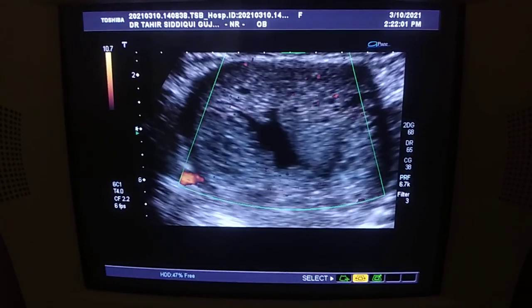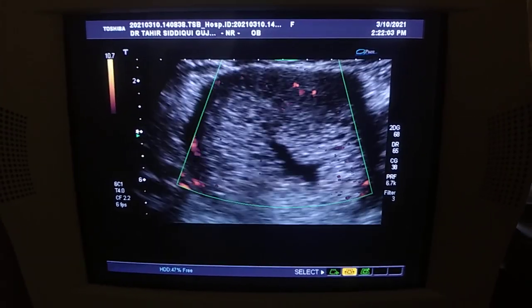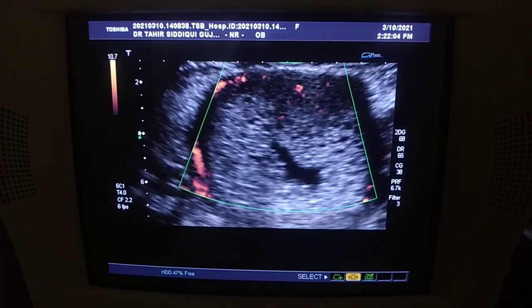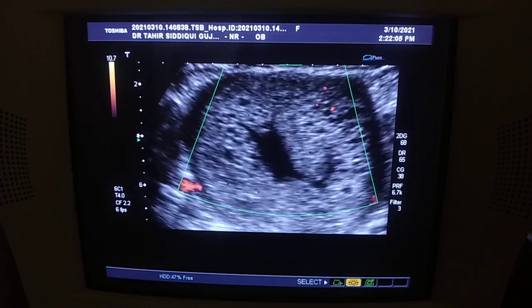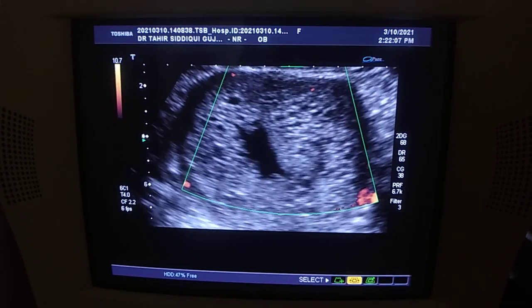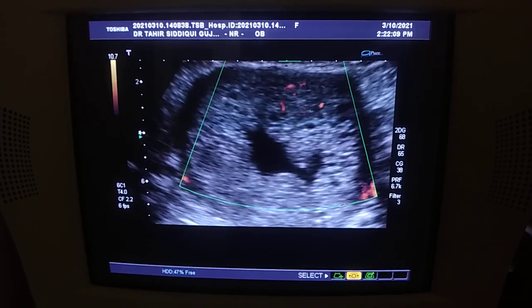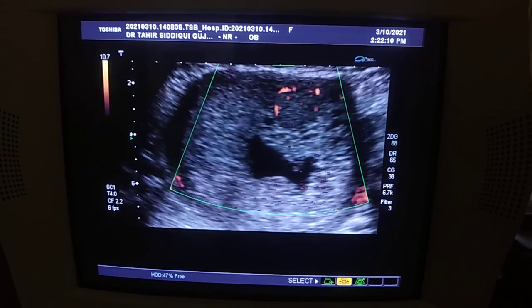Here we see blood flow on power Doppler — and this is our case of the day. Thank you very much.